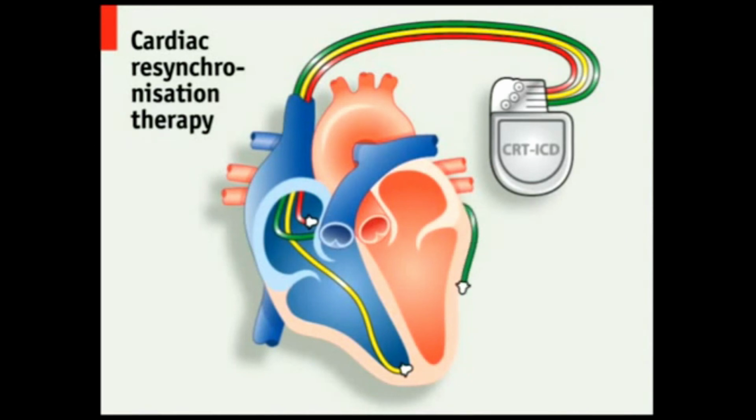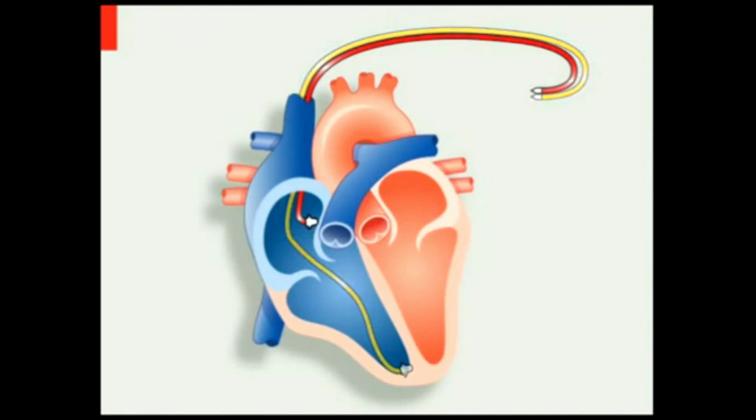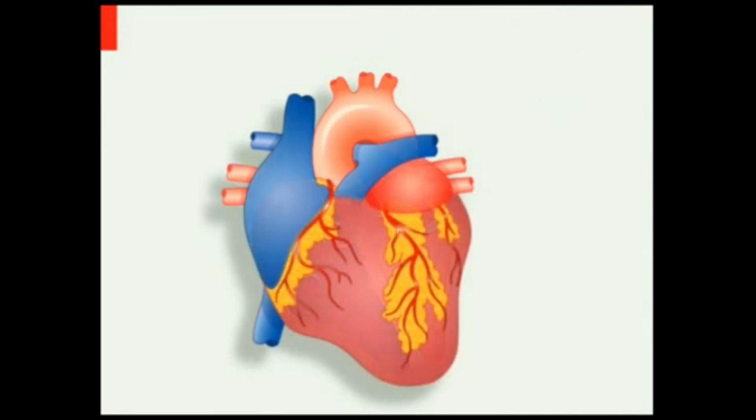These leads can cause problems of their own. Patients with these kinds of implanted devices have a 20% chance of lead failures within 10 years. Lead replacement may need open heart surgery in a few cases.